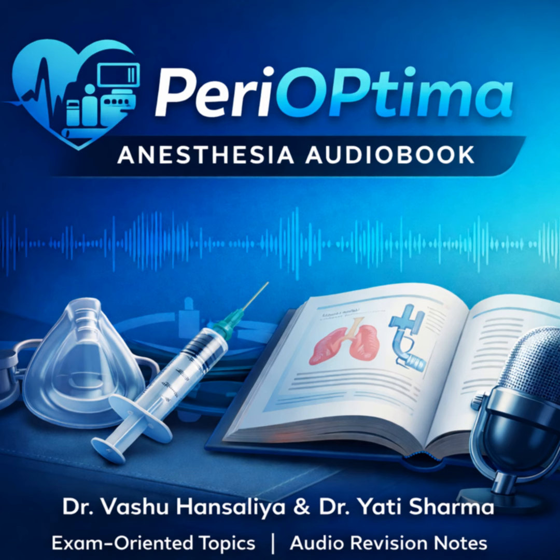Okay, let's make sure the written paper is covered. Diagrams and exam presentation: how to structure that huge 20-mark answer. For any descriptive question, a well-labeled fiberoptic bronchoscope diagram is critical. You must accurately draw and label the components: insertion cord, control lever, working channel, eyepiece, light bundles. It proves you understand the mechanics. And the visualization component. You should be prepared to list and describe the airway anatomy landmarks as seen on bronchoscopy, the sequence: epiglottis, vocal folds, arytenoids, then the tracheal rings, the carina, and the bronchial bifurcations. It shows you know what success looks like.